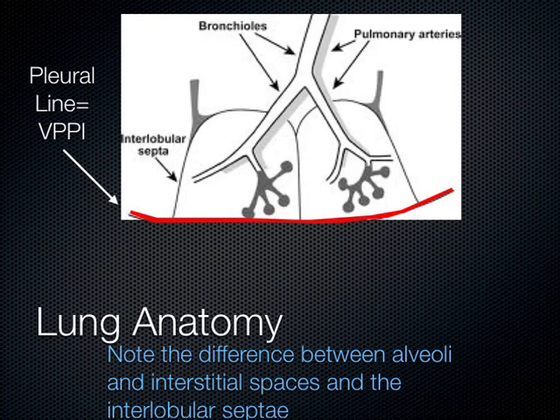Also, in most people, these interlobular septae are about 7 millimeters apart. It's not key that you remember that number per se, but just approximate in your head about how far these structures are apart.